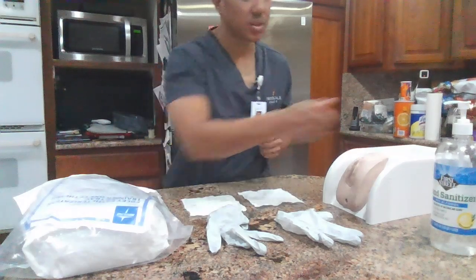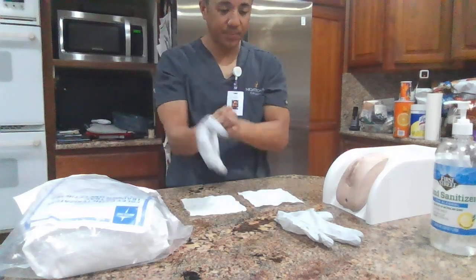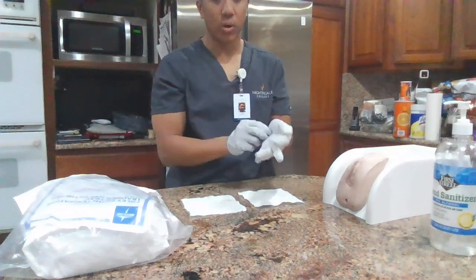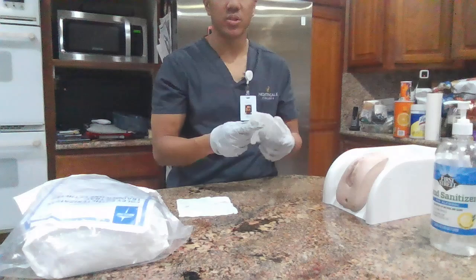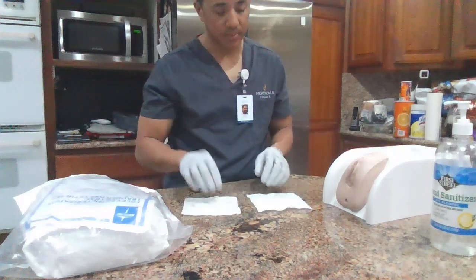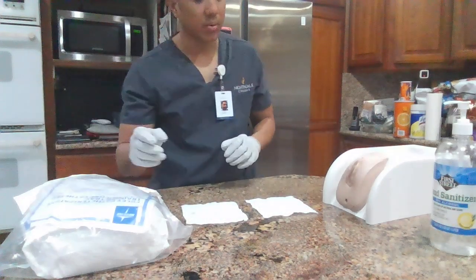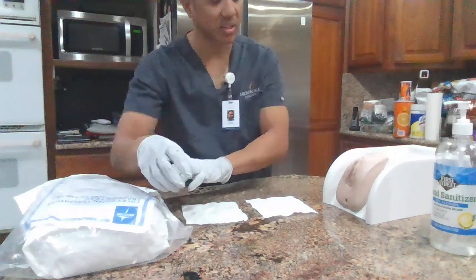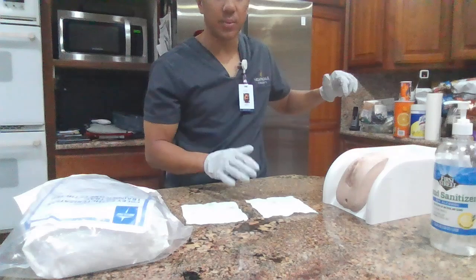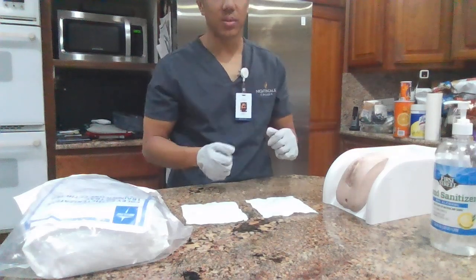Okay. So I'm going to perform hand hygiene. I'm going to put on my gloves. So I have two washcloths. I have one wet cloth that has a no-rinse soap base, and my other washcloth is a dry cloth. First, I'm going to uncover her blanket. I'm going to position her legs in a frog-leg stance. I'm going to adjust the height of the bed so it's accessible for me to work. And since I am right-handed, I am going to stand on the right side of the patient.